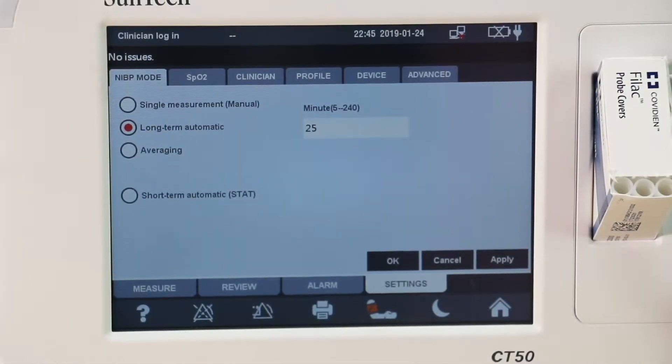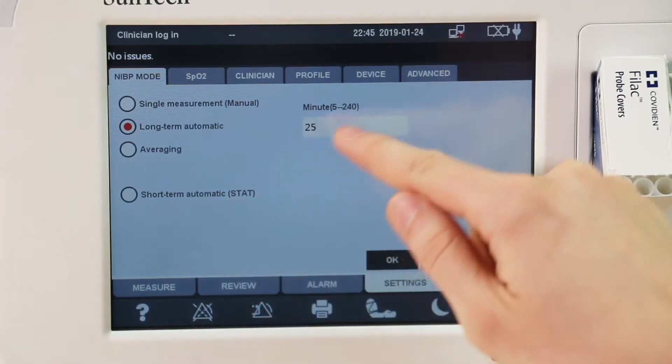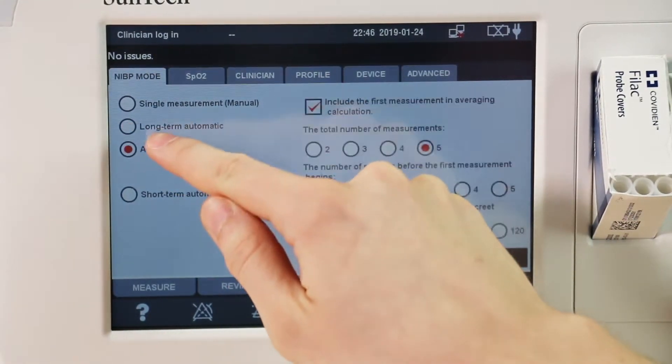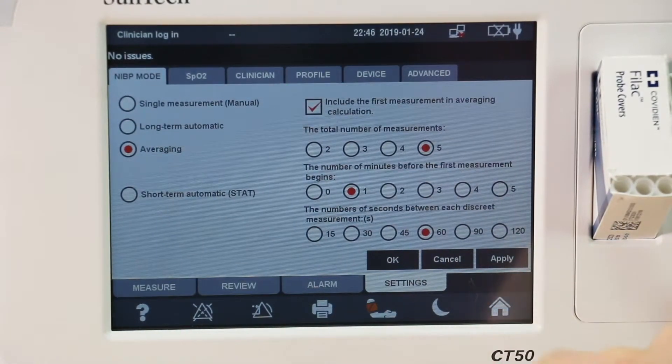Visit Settings, NIBP to select between the four modes. For either long-term or average measurements, be sure to set the duration or intervals. Return Home. Confirm the mode and patient type on the display.